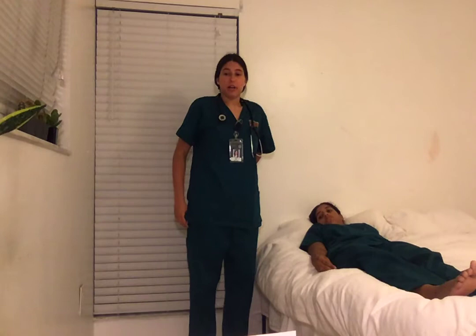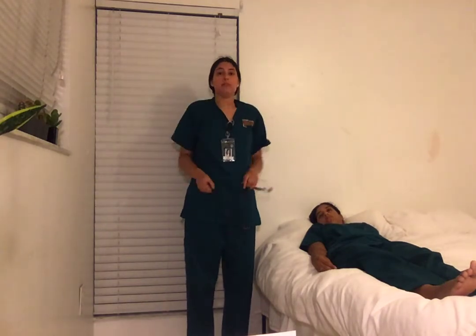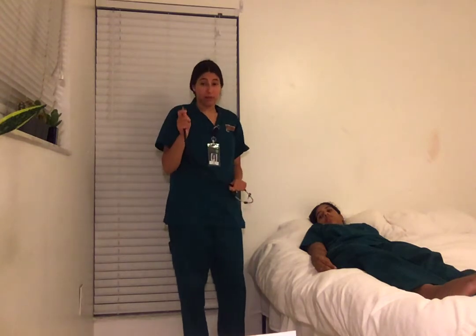Next, I'm going to listen to the carotid artery for bruits. So I would use the bell of my stethoscope.